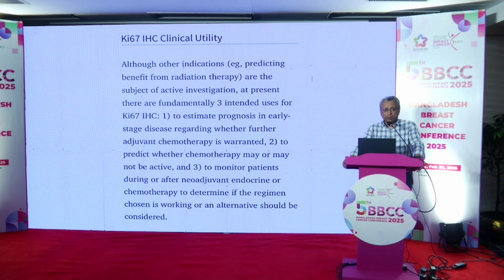And in our hospital or lab, we don't get a request for Ki67 that often. It mostly comes from private oncologists. They ask for Ki67, but not in routine practice. We don't have these requests. But there are, of course, benefits of doing Ki67 stains, especially as a prognostic indicator for therapy response and so on.